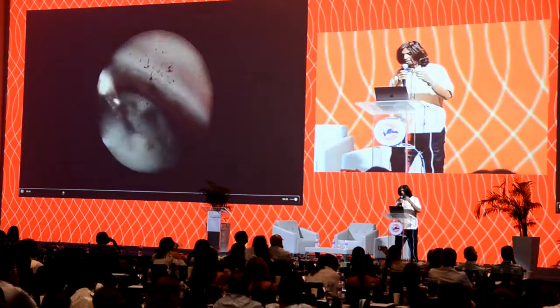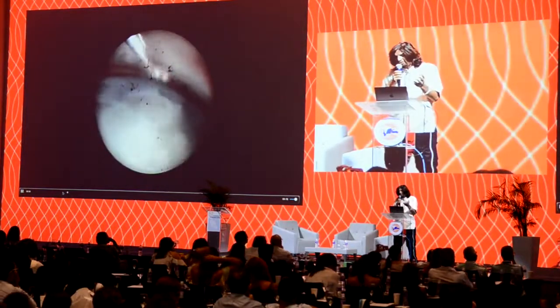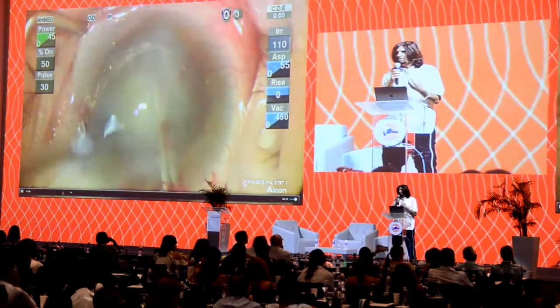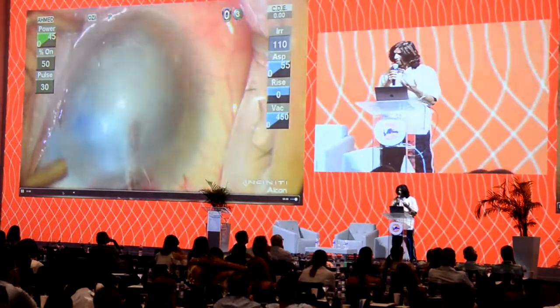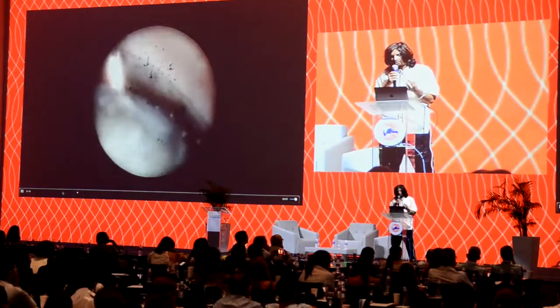We're going to use our left hand here through a paracentesis to start the rhexis with a microforceps, looking into the eye. So this is, yes, not a routine case. I realize that, but I want to just put it out there that I had never done a case like this, and this was probably about, I don't know how many years ago, maybe 7-8 years ago. I had never done a case like this before, but we prepared really well, read the literature, and were familiar with our endoscopy.